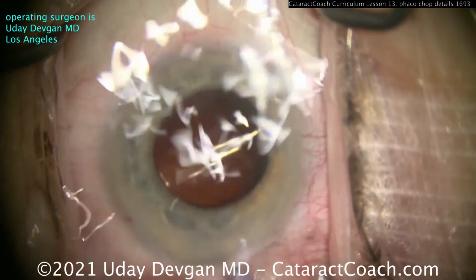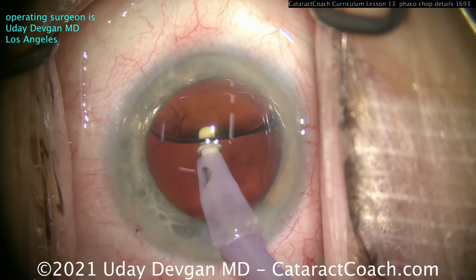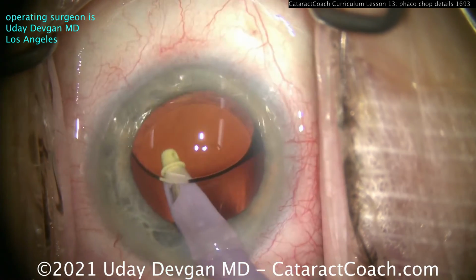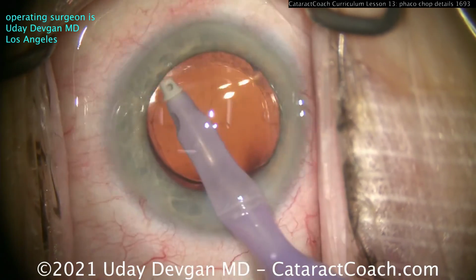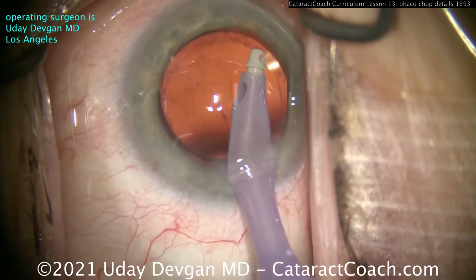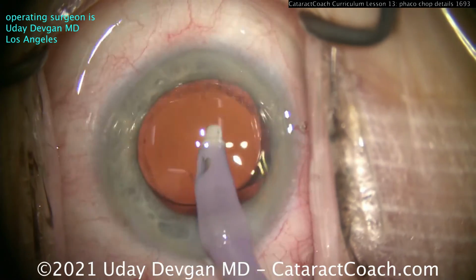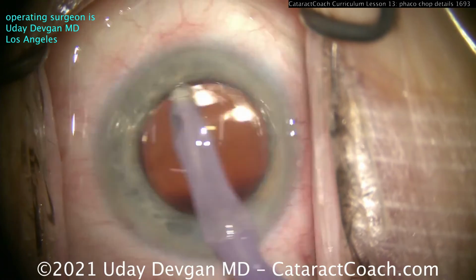And you can see that rhexis looks great, overlaps the optic. But this is not a very large or big myopic eye. You can see that 6mm lens, that optic diameter, 6mm, that looks pretty big in this eye. So the total dilation there is about 6mm. And again, our rhexis there is about 5 to 5.5. We'll clean up that viscoelastic, and at the end here, get that lens very nicely centered.